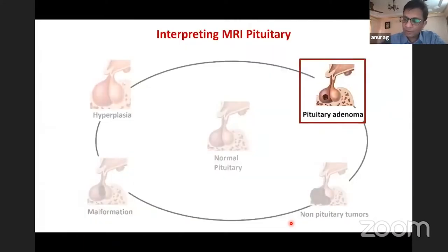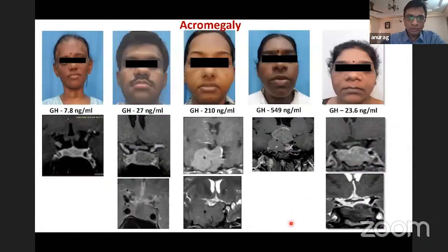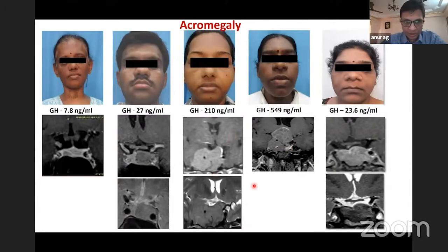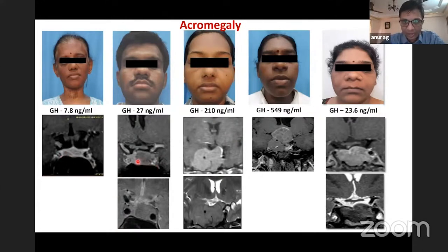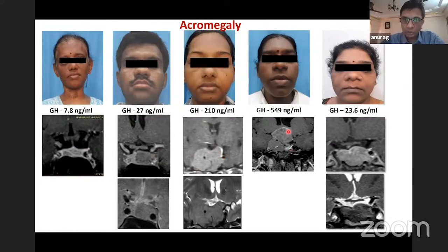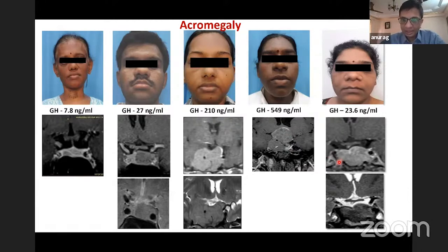Moving to adenomas — functional GH-secreting adenomas in acromegaly are mainly macroadenomas, but can also be microadenomas. They can engulf the cavernous sinus completely. Usually growth hormone-secreting tumors grow downward, but they can grow upward as well. The T2 dark signal can vary — usually they are T2 hypointense, which correlates with drug therapy response, but they may also be hyperintense.